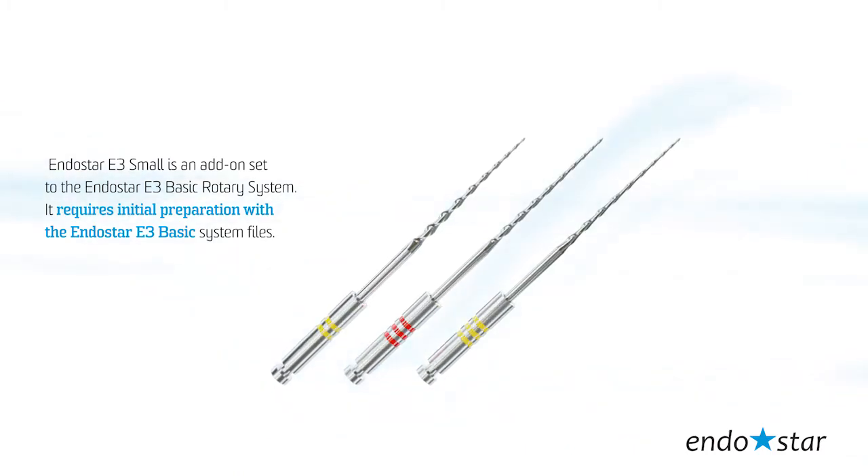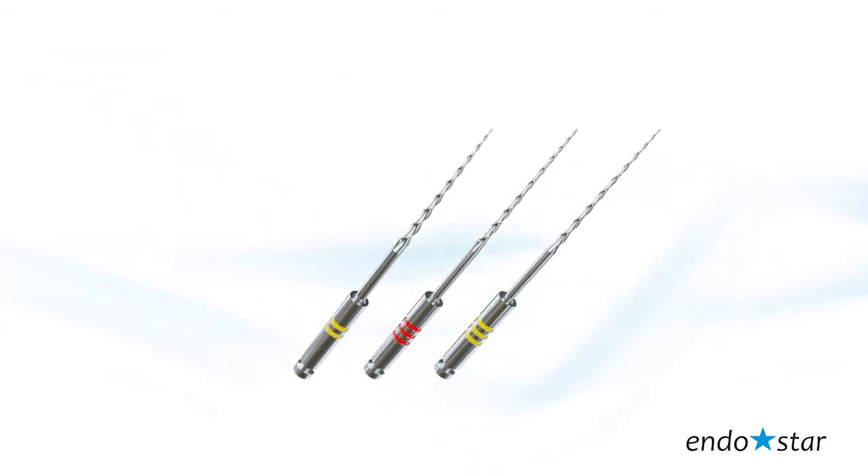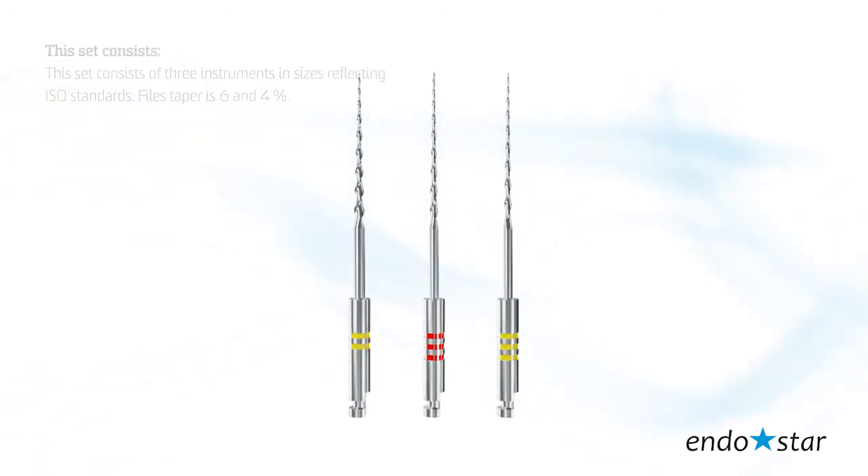It requires initial preparation with the Endostar E3 Basic system files. This set consists of three instruments in sizes reflecting ISO standards. Files have tapers 6 and 4%.